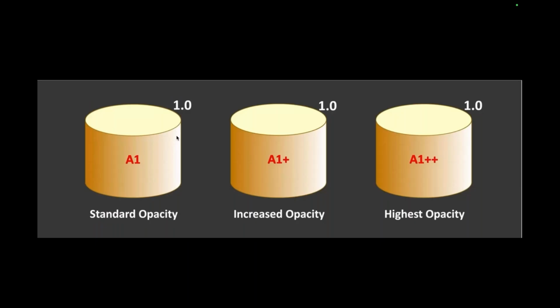So the point I was trying to make with showing you that is really simple. When I'm in layering world, I have the ability to choose. When I'm in monolithic world, I have an ability to choose, but my brain power has to shift a little bit. I have to start thinking more about space that I have and what I'm looking to achieve.